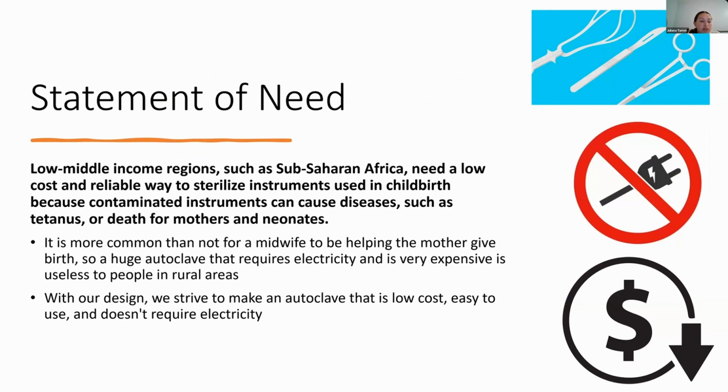Low to middle income regions such as sub-Saharan Africa need a low cost and reliable way to sterilize instruments used in childbirth because contaminated instruments can cause diseases such as tetanus or even death for mothers and neonates. With our design, we strive to create an autoclave that is low cost, easy to use, doesn't require electricity, and can be portable so those all across the sub-Saharan region can have access to a safe and healthy birthing process.